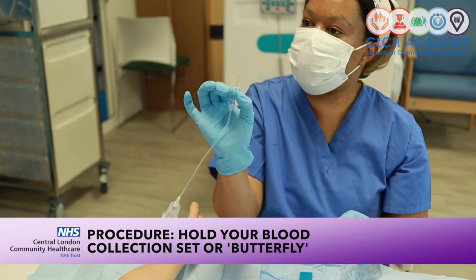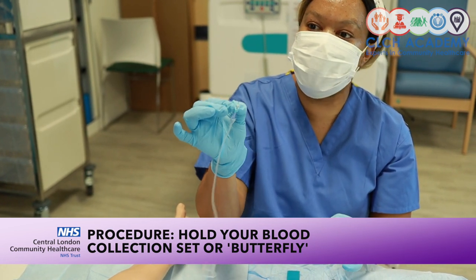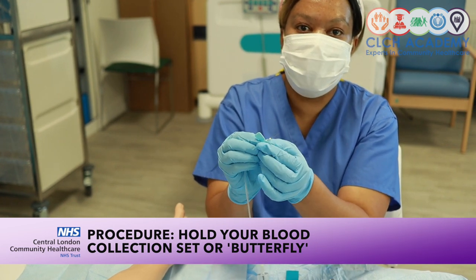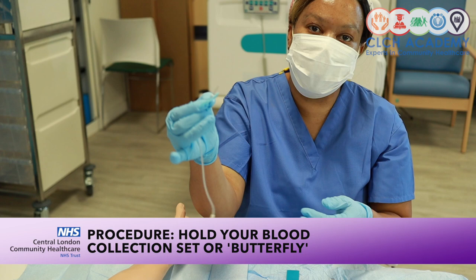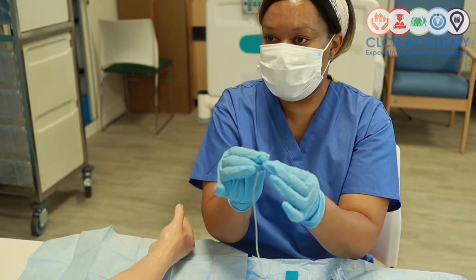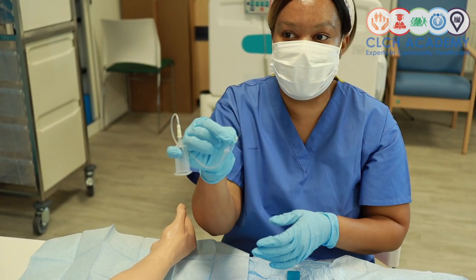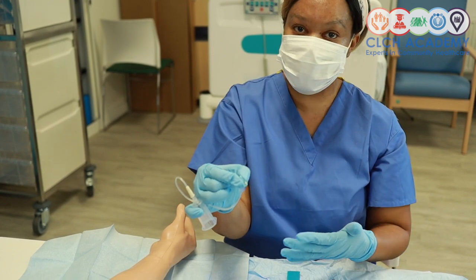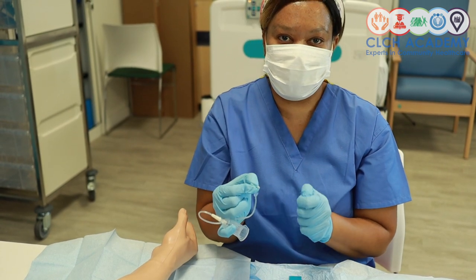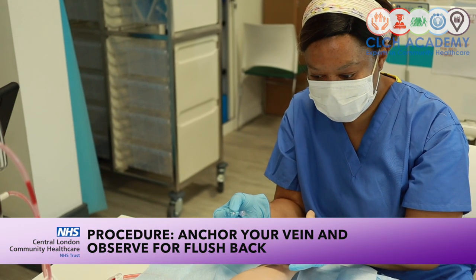Now, how people hold this needle is different. Some people like to hold the wings because that gives them better grip and control. Other people prefer to hold it like a pen, and probably that's because that's a more familiar grip for them. In this case, I am going to hold the wings because I believe that makes it more stable, and I will secure the vacutainer in my baby finger. Now, you don't need to do that, but I feel like it saves me from chasing the vacutainer with my bottles when I'm ready. Right, as I said earlier, I've already cleaned the skin.